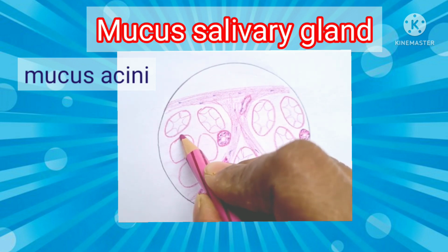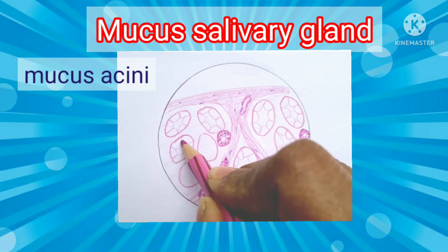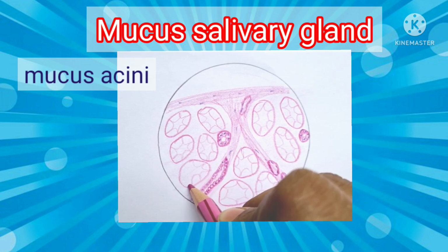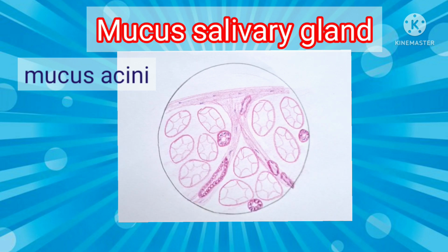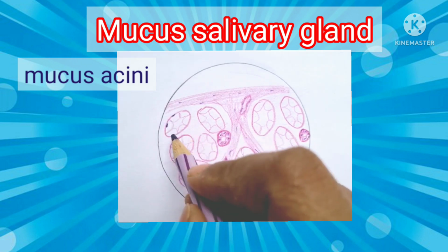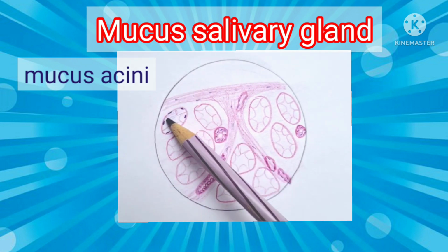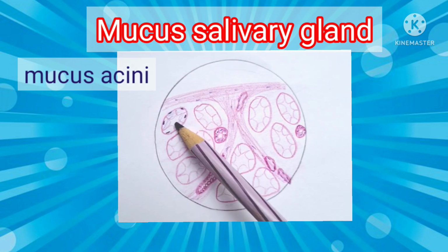So during the staining procedure it will be lost. These granules will push the nucleus towards the base. When the round part is pushed, it will become flat, no? So the nucleus will be flat and towards the base of the cell. And the cytoplasm is a little basophilic because of its secretions.